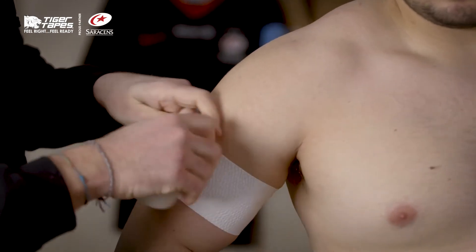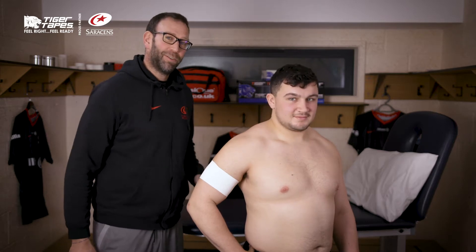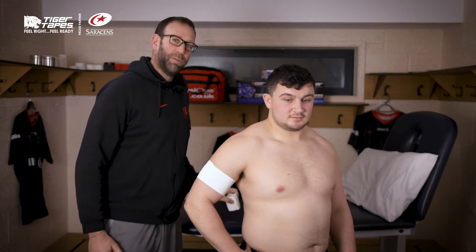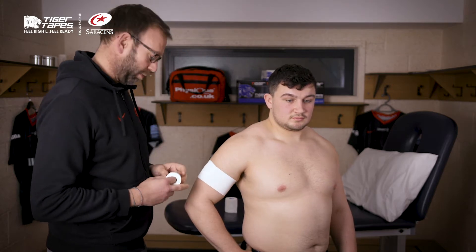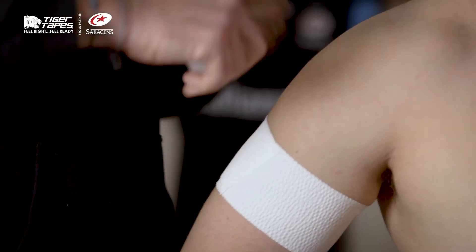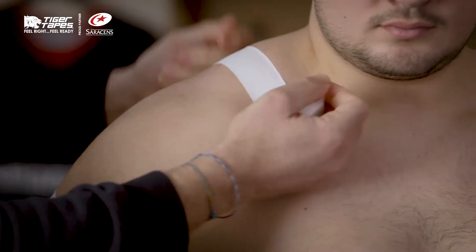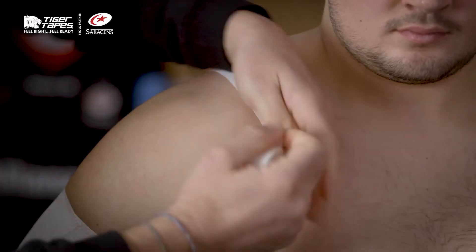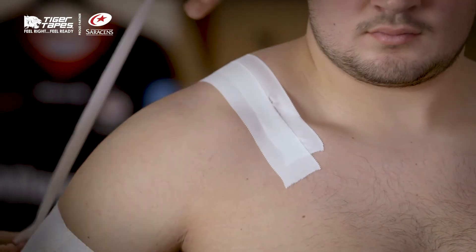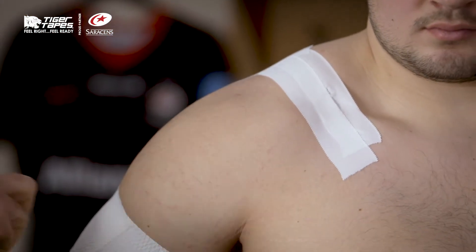Just an anchor to start with. We can use the Tiger Tear Stretch Tape which is 7.5cm just to anchor, and we can use the Zinc Oxide Tiger Tape 3.8cm. We might put a couple of anchors just across the front of the shoulder. By having the hand on the hip, it shortens the shoulder position so it gives the support.